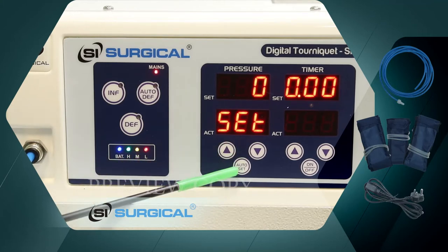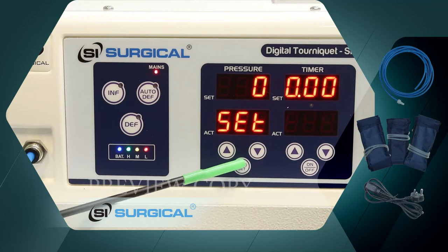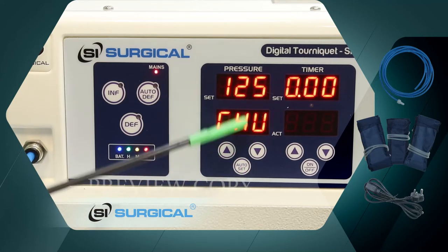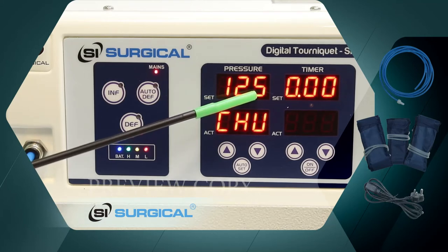These buttons increase and decrease the pressure, and this button is the auto set switch. With the auto set switch, we set it for a child as shown in the display. The pressure is 125 mmHg.